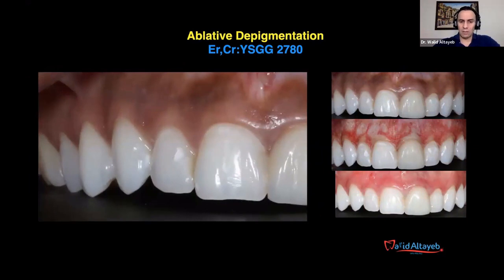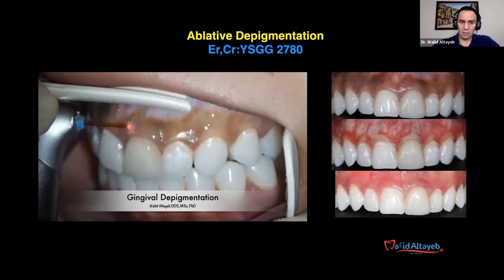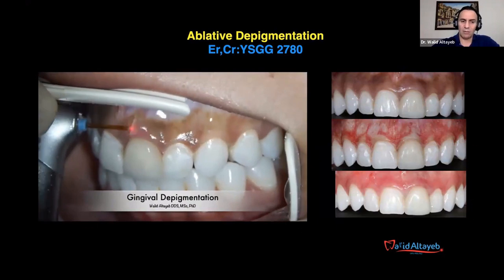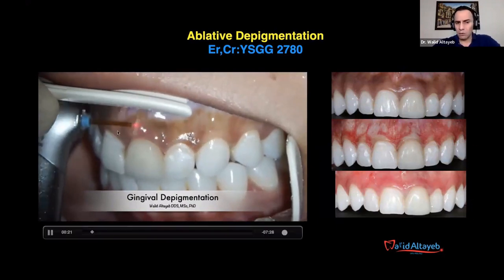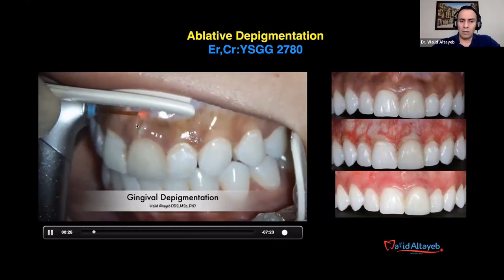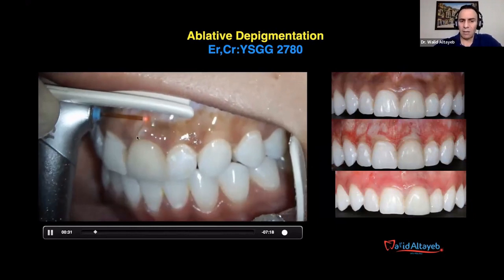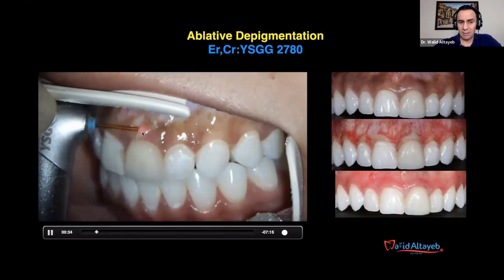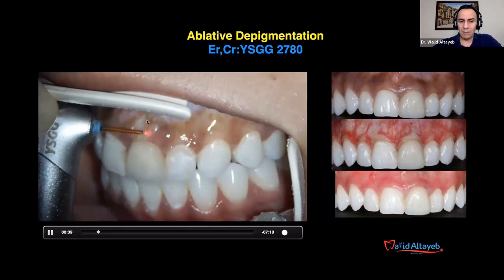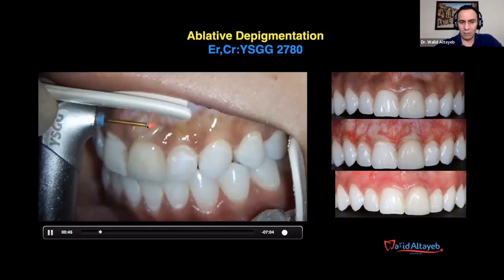First, use the short pulse duration, H mode, with heavy water irrigation and increasing the air. This will be responsible for cooling the surface so the patient will not reach a temperature that will cause damage. I prefer to use the 600 micron tip, the MZ6, and we work with the same angulation that we mentioned with diode. And the good thing about the erbium is that it is fast, without anesthesia, and it's clean. It's very easy to distinguish between pigmented area or carbonized area, because we don't have carbonization with the erbium when you are using the short pulse duration.